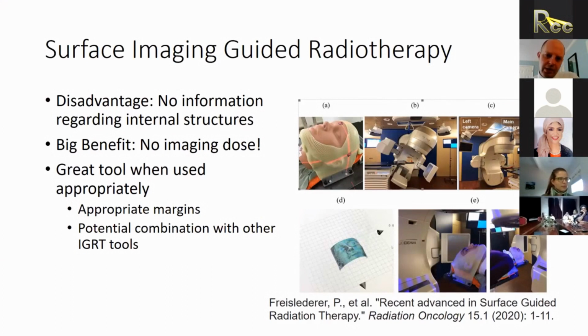Yes, and it's specifically for this surface imaging, right? So now you can see the skin itself as opposed to matching the mask. Okay. And it's double layer, isn't it? It's thick. I think so. Yeah, you can see maybe here there's a portion of it that's double layered, and a second layer that's a little bit larger. So the aim here is to expose the skin where I'm going to have surface imaging. Yes. Okay.